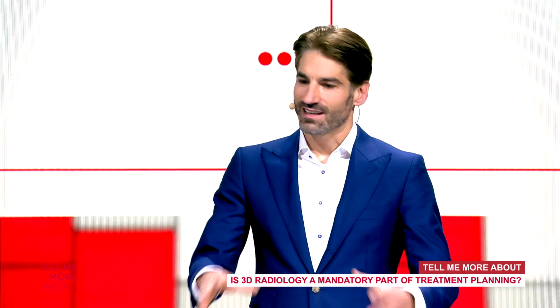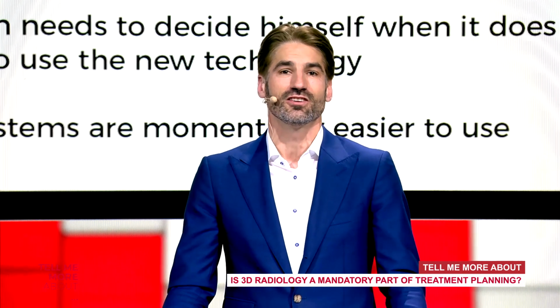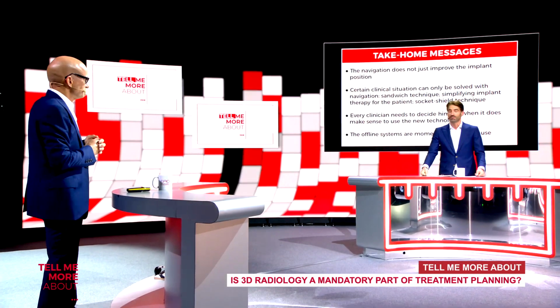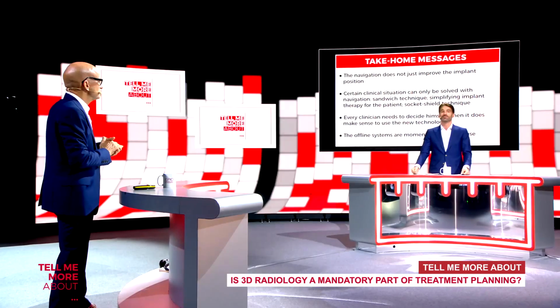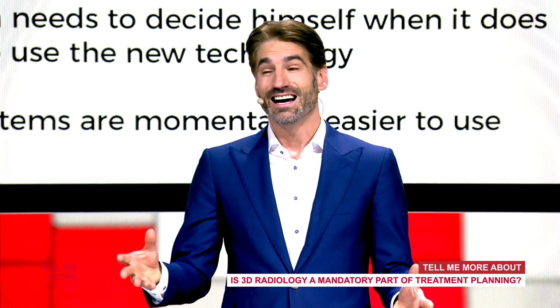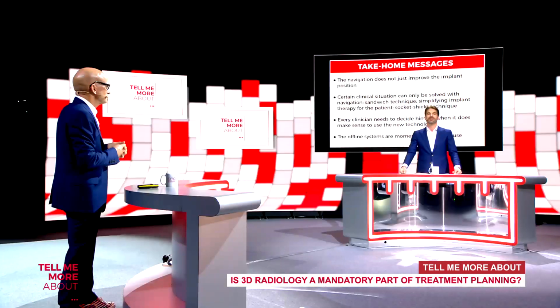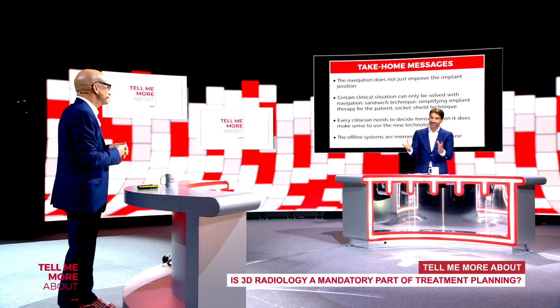Perfect. Markus, thank you so much. Let's wrap up the key take-home messages from this session. First of all, navigation does not just improve the implant position, but we saw also all the other benefits in the treatment planning and protocol. Second, certain clinical situations can only be solved with navigation, for example the brand new socket shield technique that you mentioned. Number 3, I hear you say that in the end, every clinician needs to decide him or herself whether it makes sense to use this new technology, right? I see you nodding. And 4, the offline systems, the guides, are at the moment still easier to use?